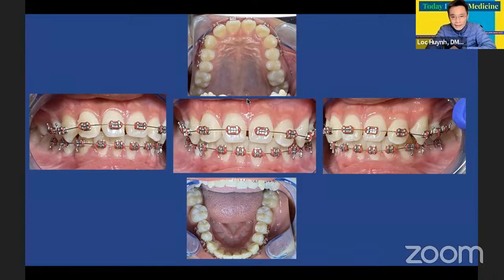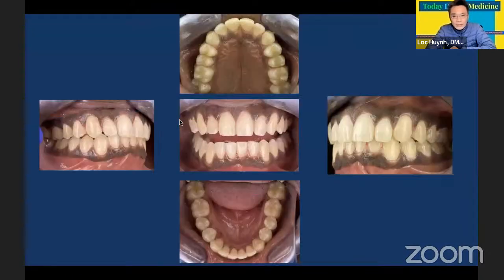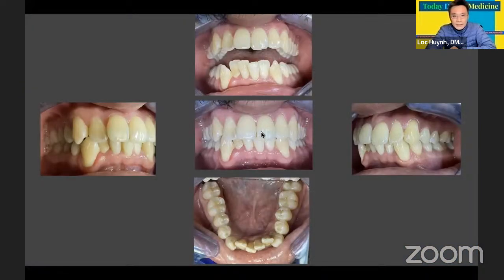You retract everything, you see teeth everywhere. And another acceptable one, you can see that everything is retracted, a nice looking one. And I want to show you, this is considered not too good. His lip is being pulled out here, you can see. So this is where you have to be more aware. When you take a photo, you can identify whether the photo is acceptable or not acceptable.